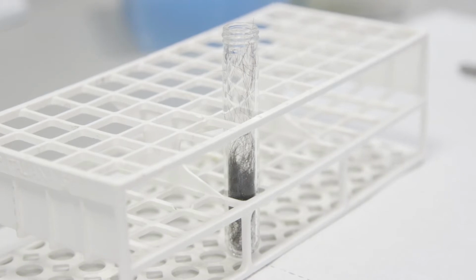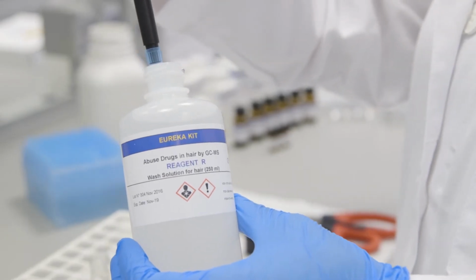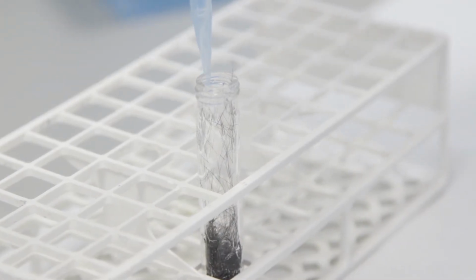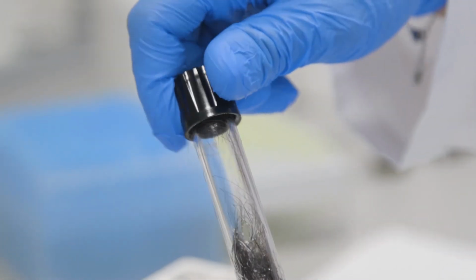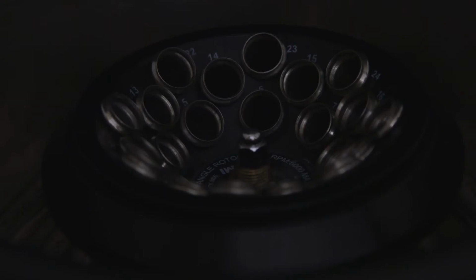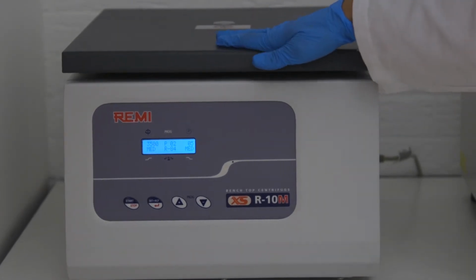Wash intact hair in a 10 ml glass tube with 2 ml of reagent R. Close this tightly. Recap the tube and vortex for 1 minute. After that, you centrifuge for 5 minutes at 3500 rpm.